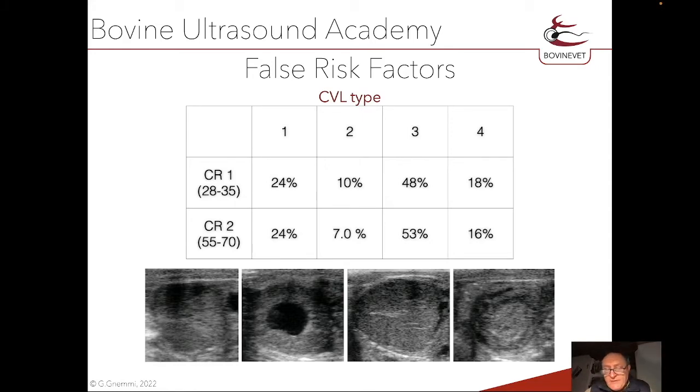At 60 days of gestation, gestational corpus luteum are still more than 7% with a cavity. Therefore, making a negative diagnosis of gestation solely on the basis of the presence of a cavitary corpus luteum carries an enormous risk of false negative. We can therefore say that this is a hypothesis with very low sensitivity.